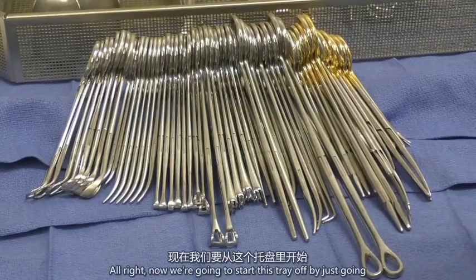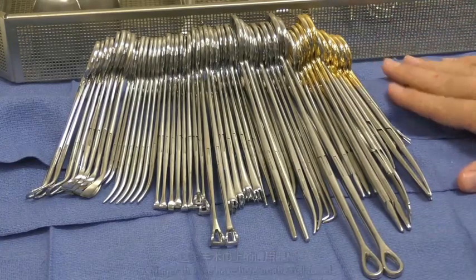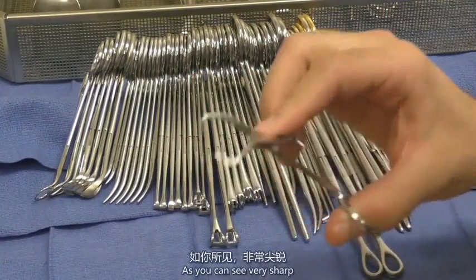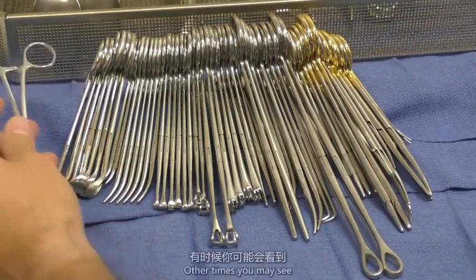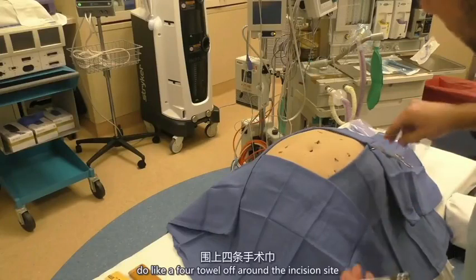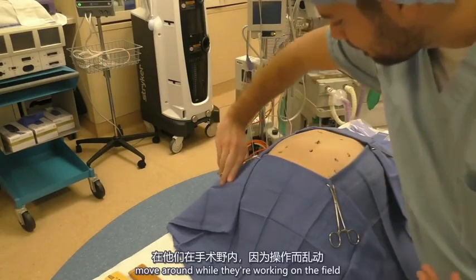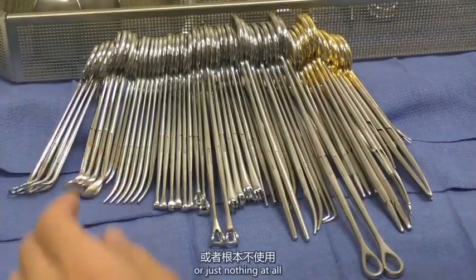Alright, now we're going to start this tray off by just going through the general instrument stringer that we have here on the roll towel. So starting it off, we've got 4 sharp towel clips, also known as the Backhaus towel clips. As you can see, very sharp. These can pierce patient's skin, and a lot of the time surgeons do use it for that application. Other times you may see surgeons do a 4 towel off around the incision site. A lot of the times they'll like to use this Backhaus towel clip and clip the corners of the towels together so the towels don't move around while they're working on the field. Other times you may see them use a disposable stapler for that, or just nothing at all.